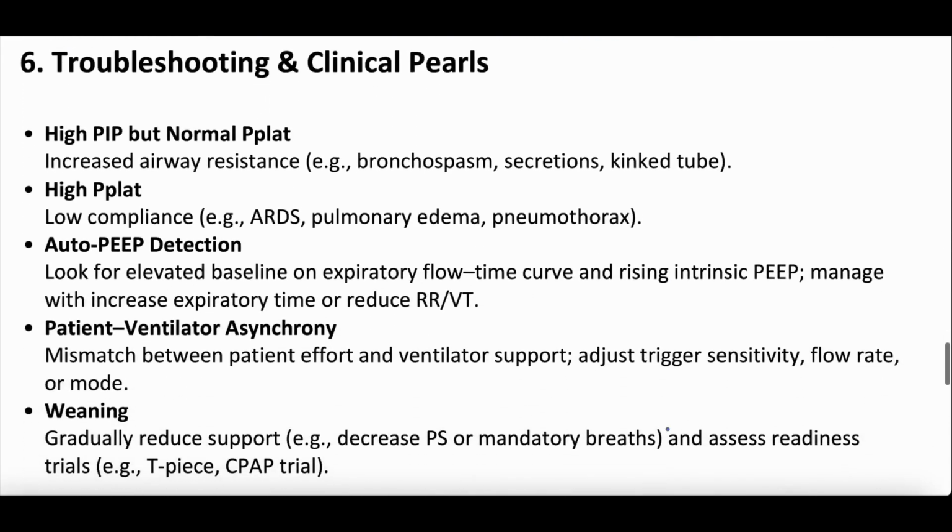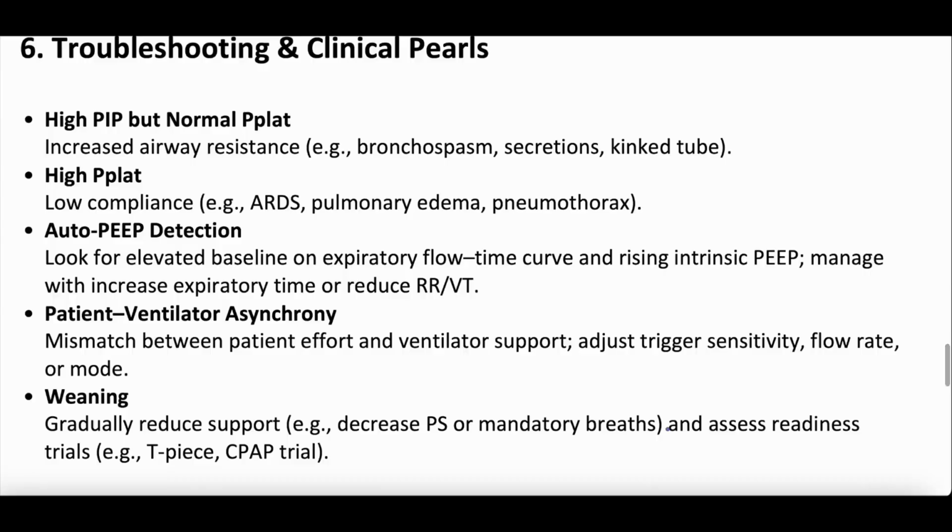Troubleshooting and clinical pearls. I'm going to leave this here in case you want to look at it. This is a little outside of this video, but I wanted to include it here because it helps you understand plateau pressures, PEEPs, auto PEEPs, ventilator desynchrony, how to wean, which are all separate episodes. But for the sake of comprehension, it's here if you want to pause and take a look at it.